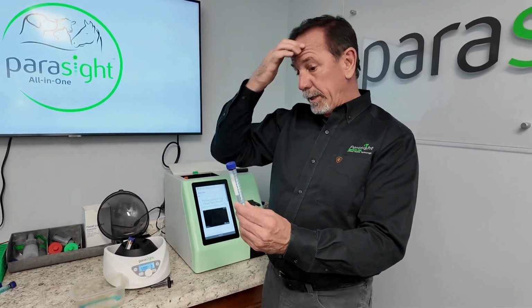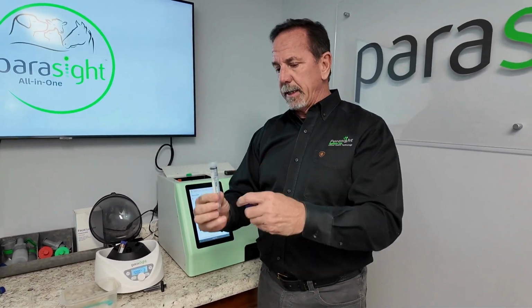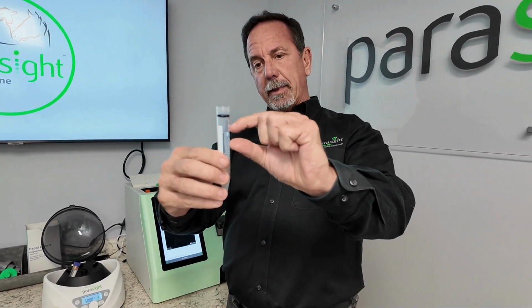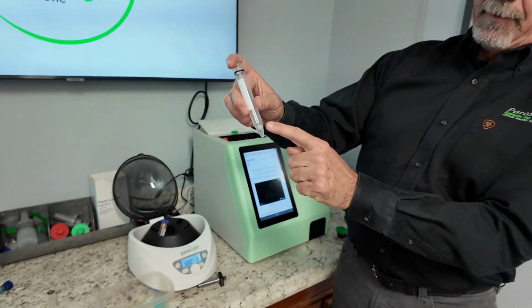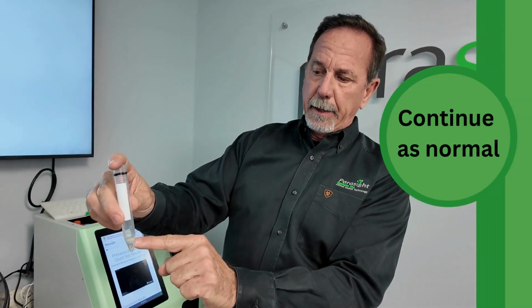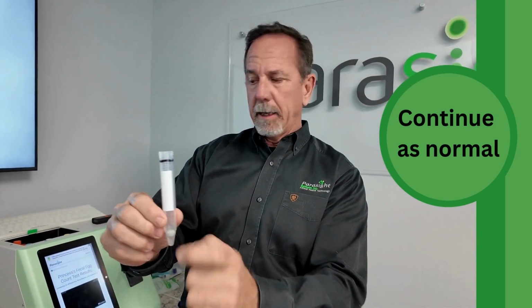And now what we're going to do is we're going to take that full amount. We're not going to worry about anything in there. You'll see a pellet at the bottom, and you'll see a mucus plug up at the top. And you're going to go ahead and pour the mucus plug and everything out. So all you'll do is you'll have a pellet at the bottom, along with the agitator here, and you'll have nothing else in there. Okay?